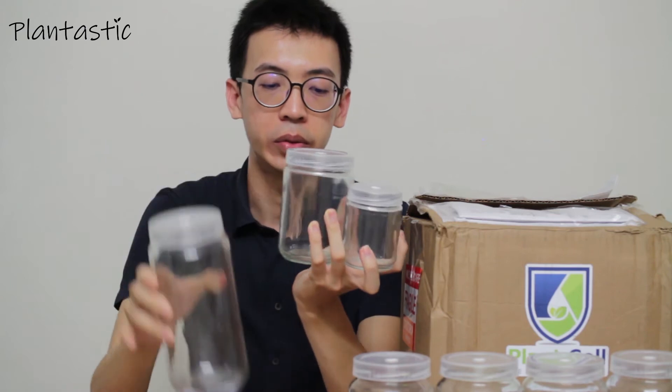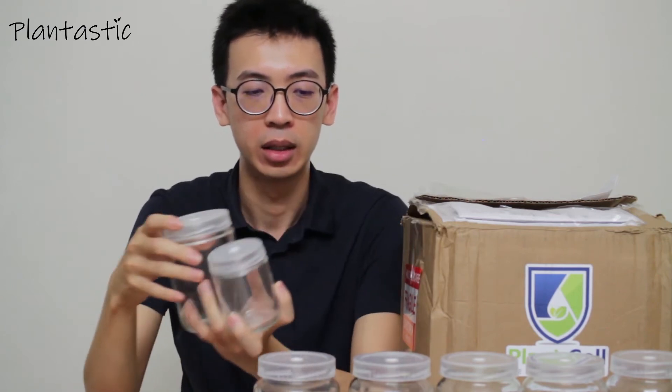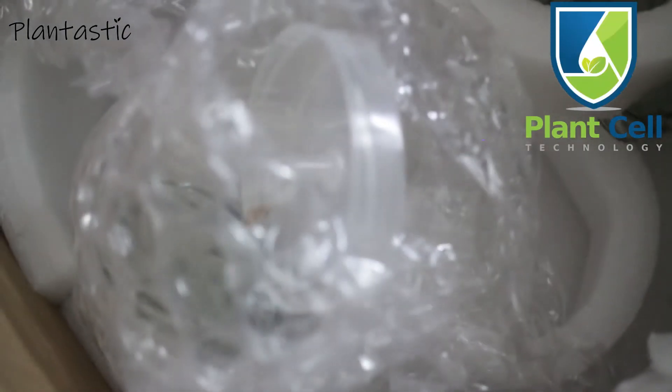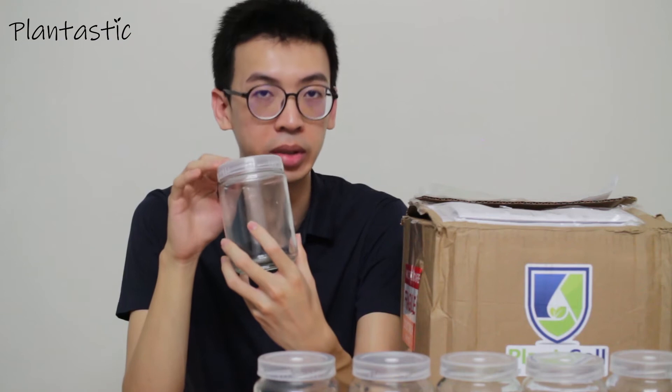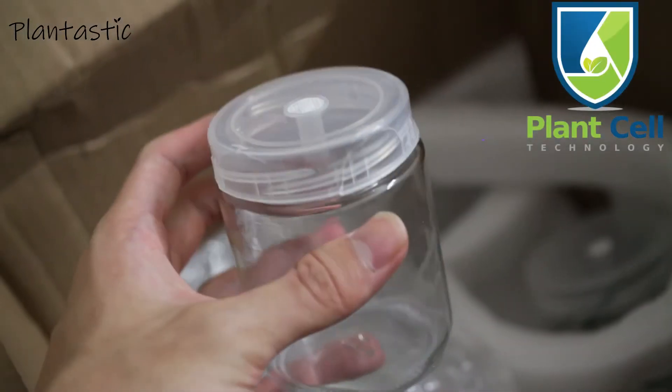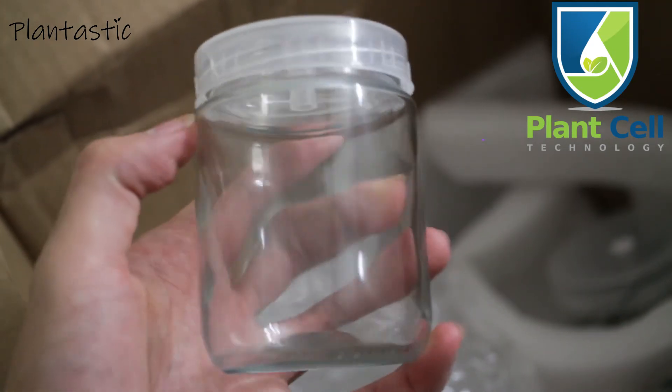Throughout the shipping, 2 of the medium jars already cracked, but the cap is still in good condition. One of the caps is already cracked. So I can say generally the delivery is very good in condition, whereby the majority of the glassware are still in very good condition.